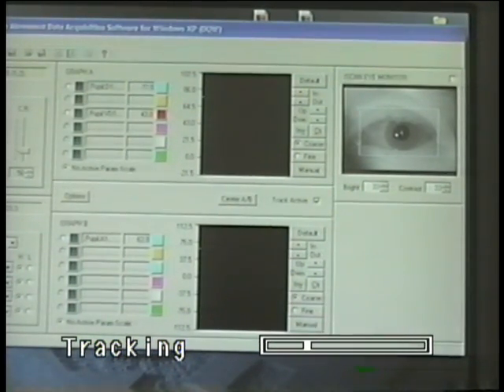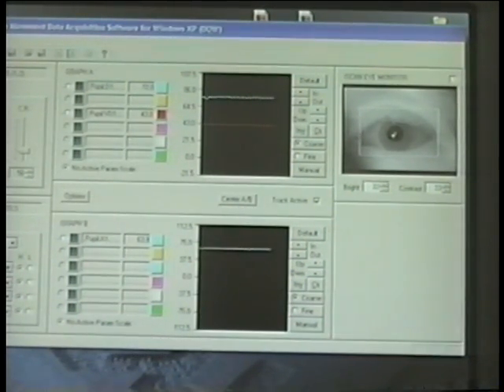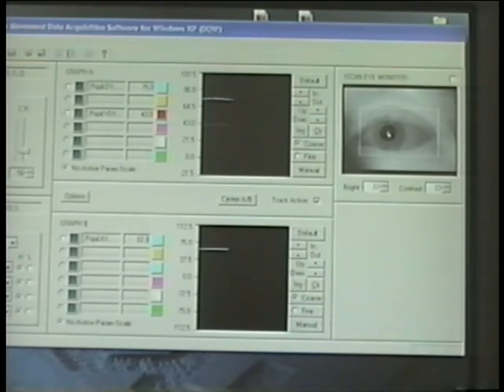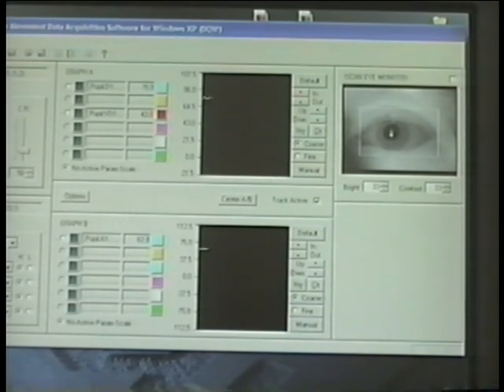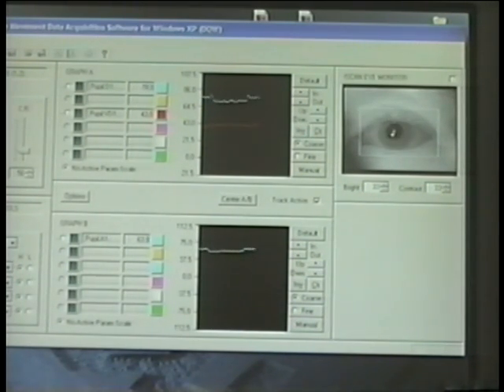This tape is a demonstration of iSCAN's pupillometry system that is used in toxicology, drug testing, and behavioral science applications. We are measuring the horizontal and vertical diameters of the pupil and also the area of the pupil.